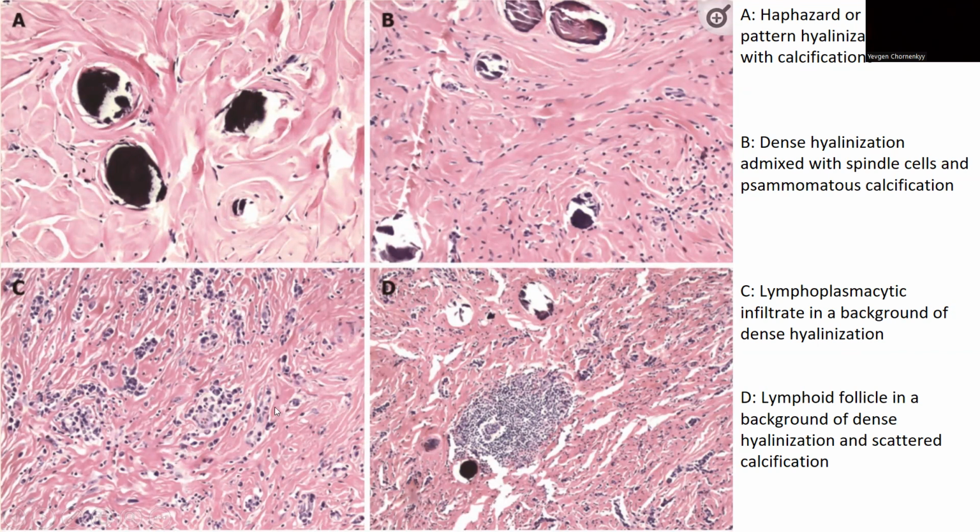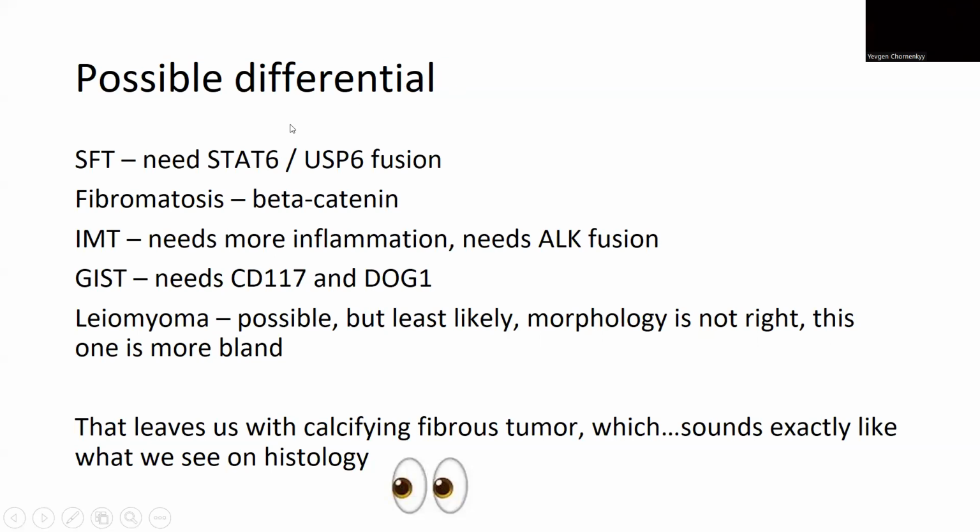It's just not as much, and there could be some background lymphoid follicle aggregation.